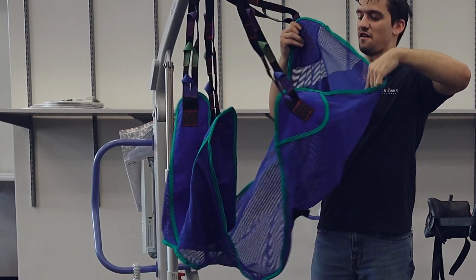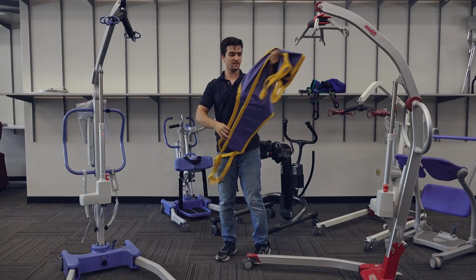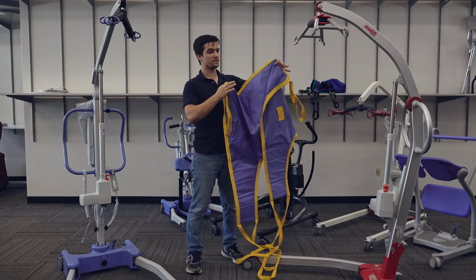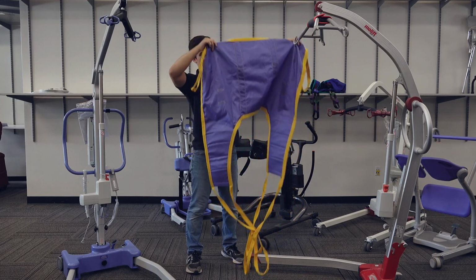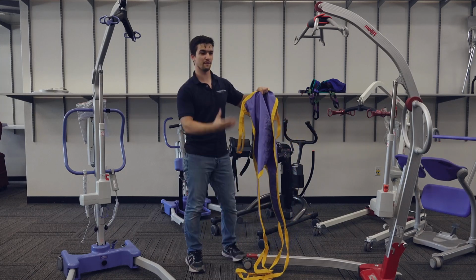The alternative sling is called a cross leg sling. This one comes in a U shape. And this sling was designed to be removed and put onto the user easier from a chair position. So if the user is seated in the chair, you'd lean their back forward. This drops behind them, and then we're going to go underneath each of their thighs and then lift up from there.